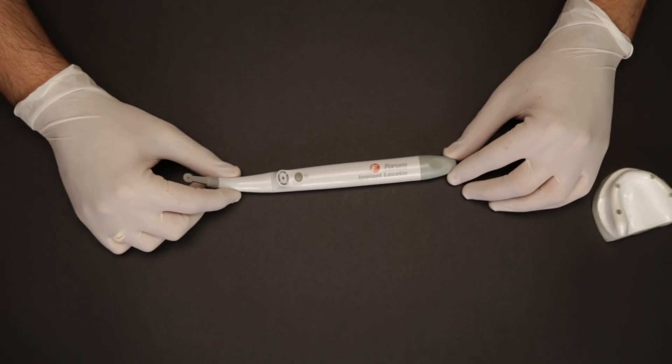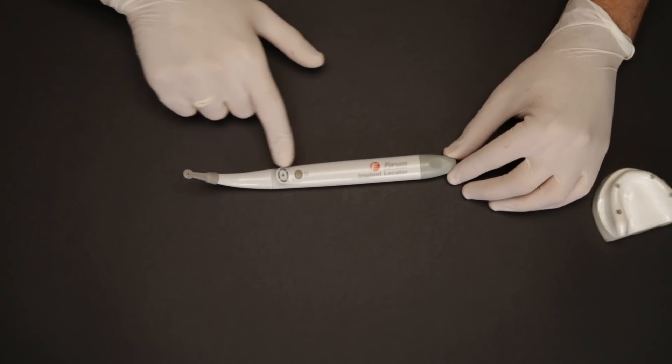This is the implant locator which I have been talking about, and you can say this is a kind of a dental metal detector.